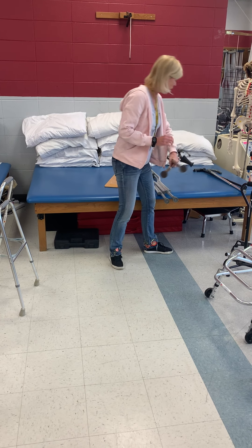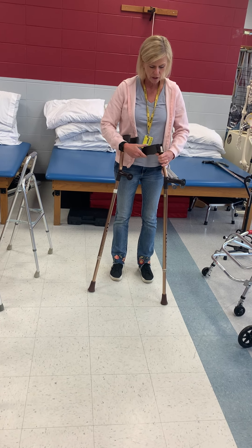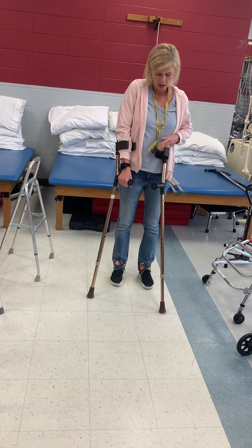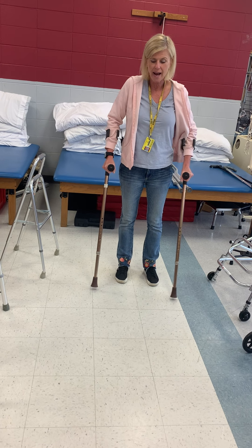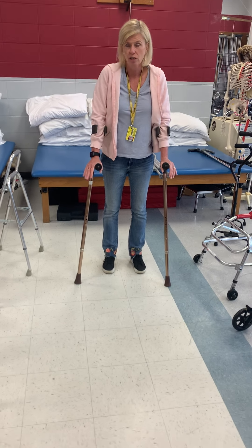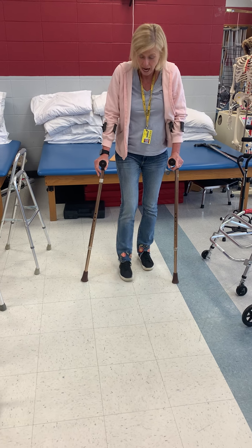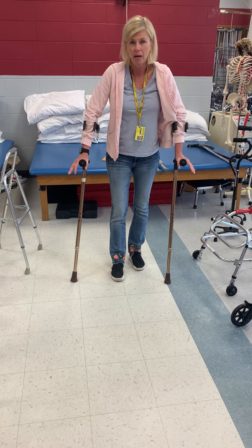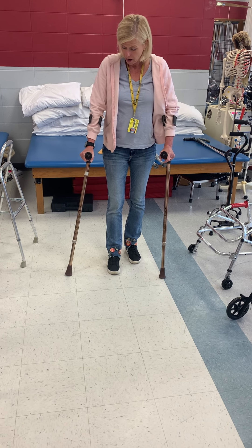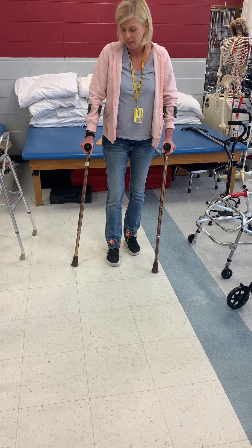These are called forearm crutches or Lofstrand crutches. We issue these to patients who are going to be on crutches for a long period of time — patients with cerebral palsy who may always need crutches, or somebody who needs to be non-weight-bearing for three months. They're easy to get on and off, usually lighter in weight, and they won't hurt your brachial plexus either.